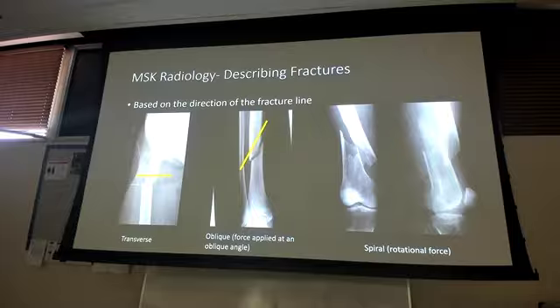Honestly, a radiologist would not even accept it if they did it the other way. Before it even gets to you, they would look at it and say, no, flip it around and do it the right way, because that's the way they're trained to read it. But almost all of your x-rays, outside of hand and wrist, which they do PA just because it's easier to lay the hands flat on the film, and chest, those frontal views are AP. Femur, knee, tib-fib, shoulder, spines, all of that is going to be AP and a lateral, just so you guys are thinking from a position standpoint.